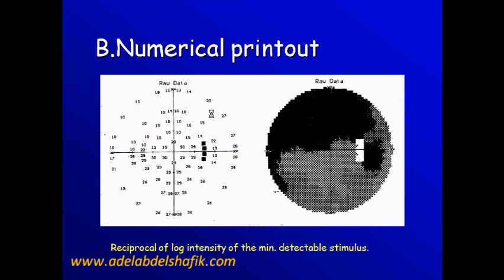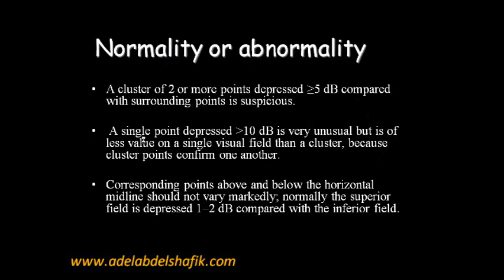The numerical values are numbers written here — this is the sensitivity of each location of the retina. We get useful information from this, which we can discuss later in different subjects.